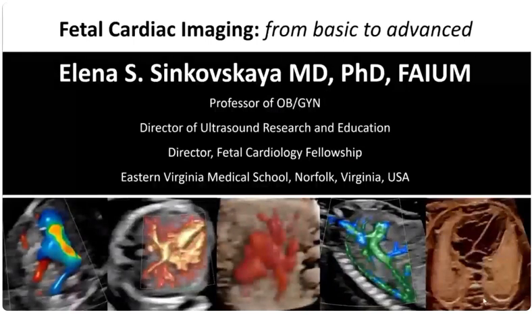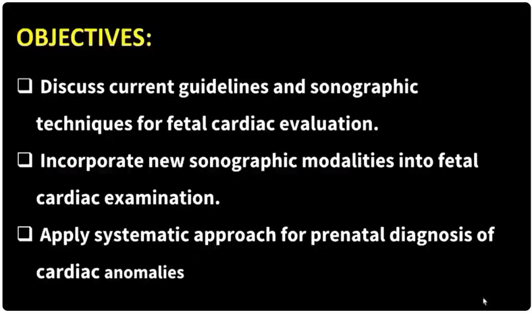Thank you, Kathy, for this kind introduction. It's my pleasure and privilege to share my experience in the field of fetal cardiac imaging with you today and present to you the latest and greatest technology of GE Healthcare for the prenatal imaging of the fetal heart. We are going to discuss current guidelines and sonographic techniques for fetal cardiac evaluation. We will see how we can incorporate new sonographic modalities into fetal cardiac assessment and apply a systematic approach for the prenatal diagnosis of the cardiac anomalies.